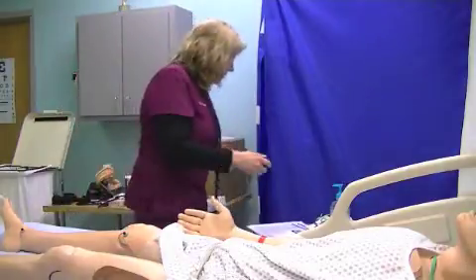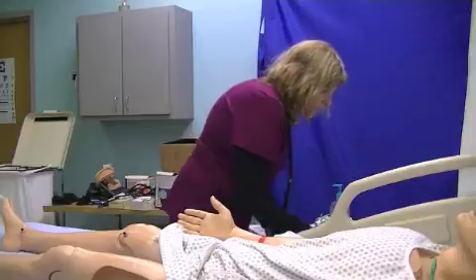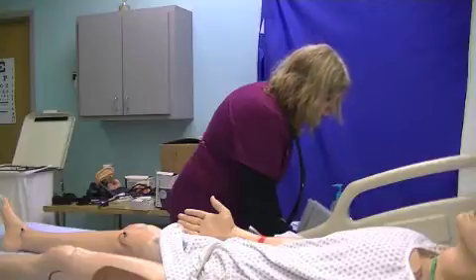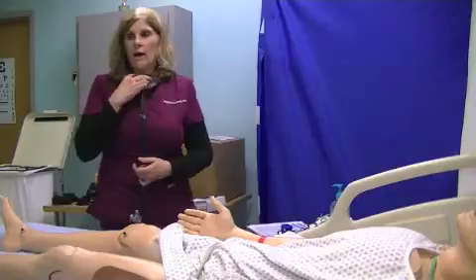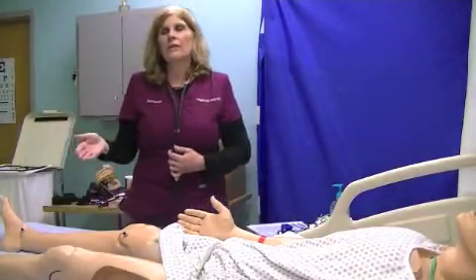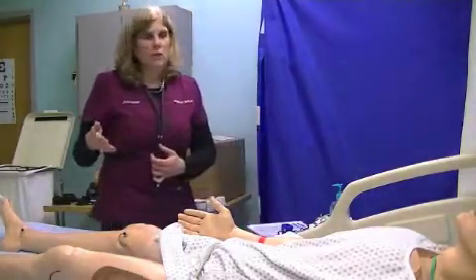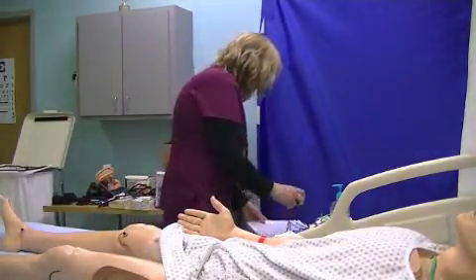So you want to make sure that you take the pulse manually, but the oxygen saturation, you can write that down. Since I'm not on oxygen, I'm going to document this as 96%. And I'm going to put RA, that means room air. That means I'm breathing 21% oxygen, which is room air. Now if I was on oxygen, you're going to read how many liters per minute, and we'll learn this later on in oxygenation. You will write that down, like 1, 2, 3, or 4 liters per minute, whatever.